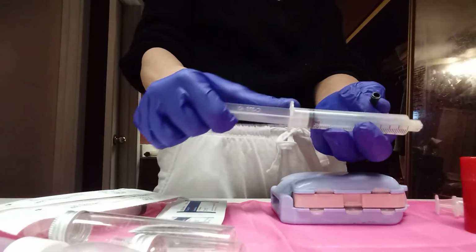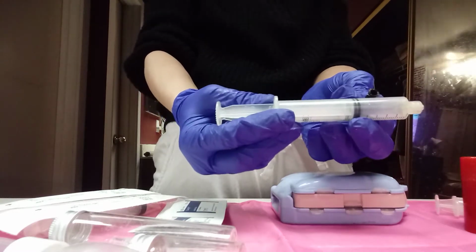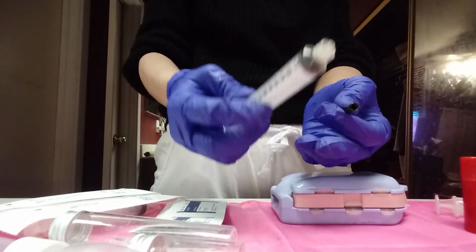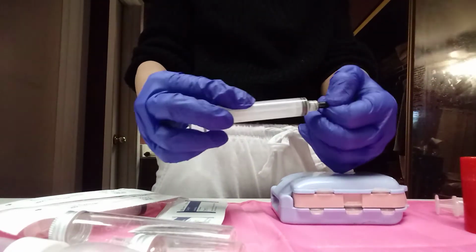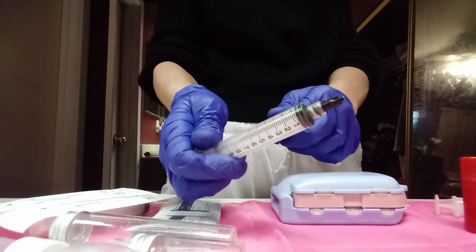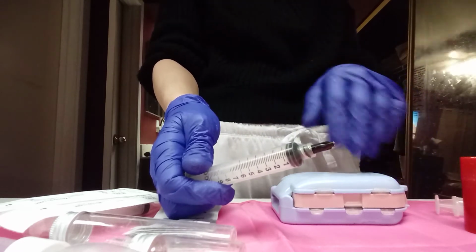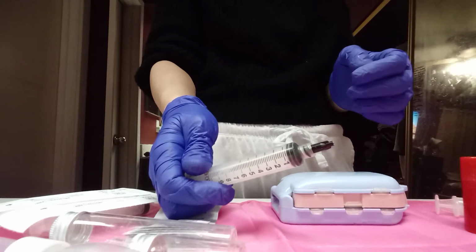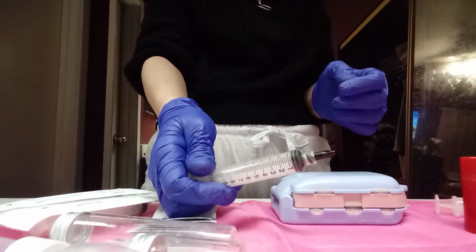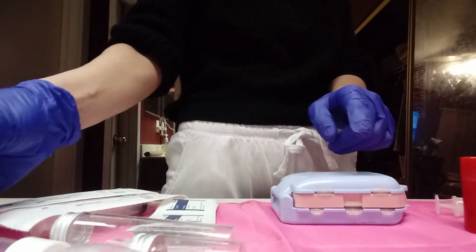The only problem is when you fill them up, this is how big they are. Or if you fill halfway, this is how big they are. So when you want your kit to be small, I would suggest to buy one of these. You put a cap on it that you get on Amazon through the blunt tip syringe. Just search for that. It's going to come up with a bunch of results. I got all different sizes. They have one that's about 6 inches, so it even reaches the bottom of the medication jar. So anyway, important to get this, okay?